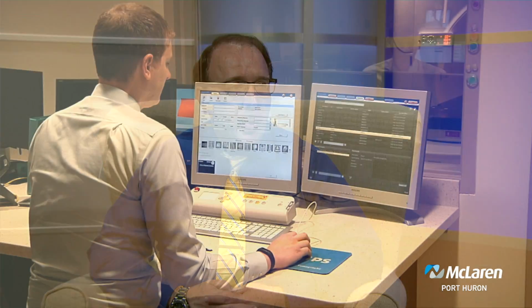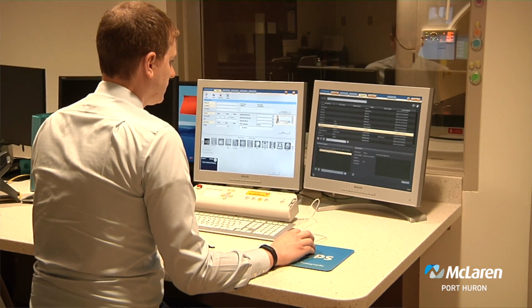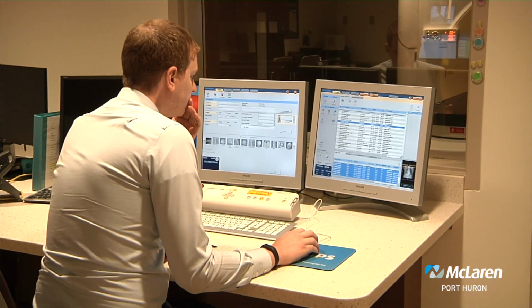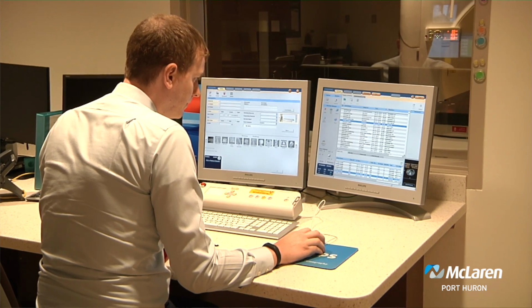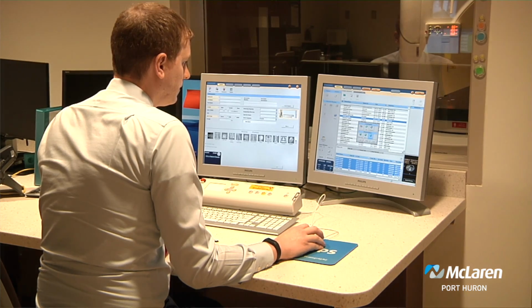So even though you don't interact with the patient other than that first visit, do you follow them to make sure that plan is carried out throughout their course of treatment? Yeah, during the course of treatment, every patient will get a cone beam CT. It's a CT that's done directly on our treatment unit, and we look at those daily to monitor the patient for any weight loss or anything that might change their anatomy. The biggest thing is, on our head and neck patients, with the combination of chemo and radiation, there's a strong possibility that they will lose weight. And when they do lose weight, that changes their anatomy, which will obviously change my plan.